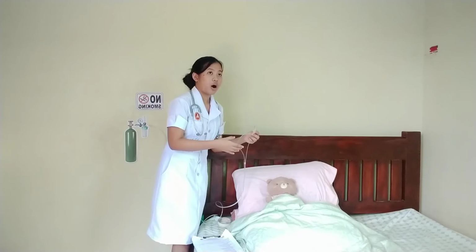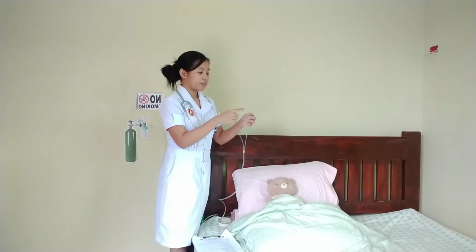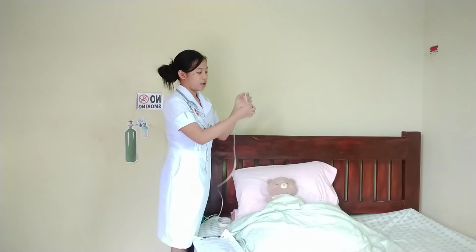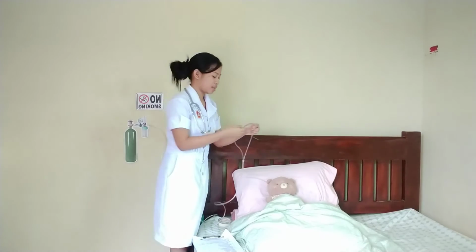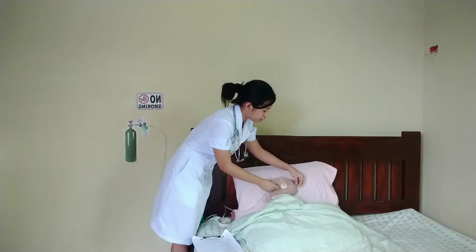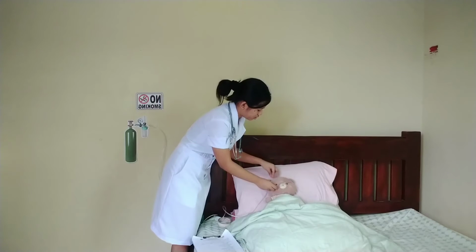So I will fit the prongs into the nares, and then I will hook the tubing to the ears of my client.